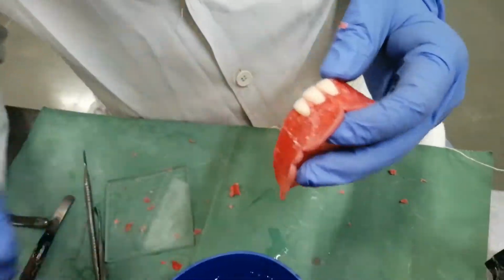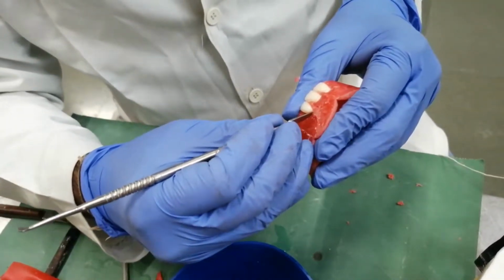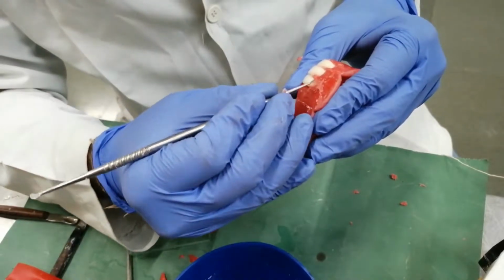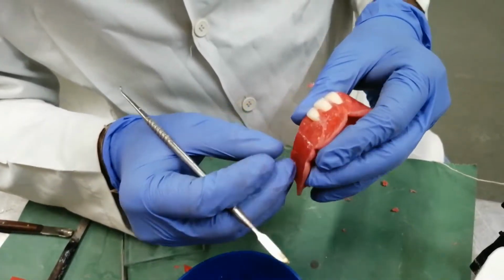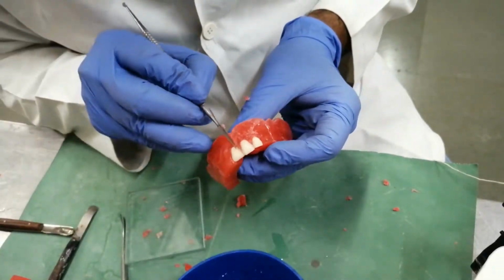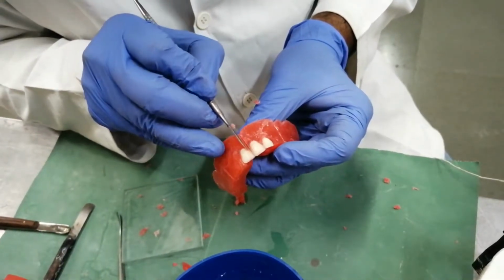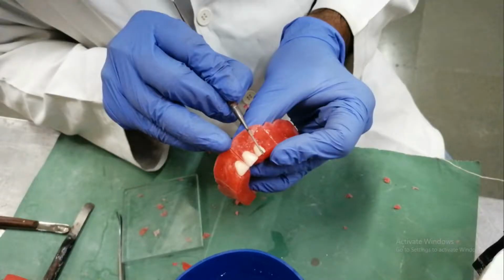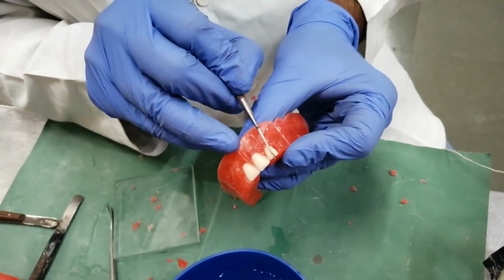According to the inclinations, the incisal edge of the lateral incisor should be 0.5 mm above the glass plate. You can see that the long axis of the lateral incisor is at certain angle. It is not parallel to the long axis of the central incisor. Incisal edge of the lateral incisor should incline mesially and the neck of the lateral incisor should be inclined distally.